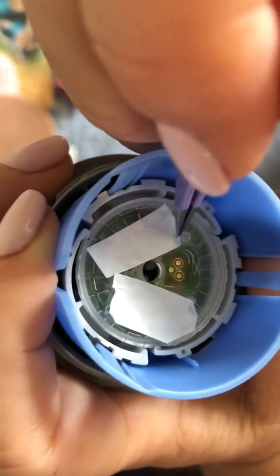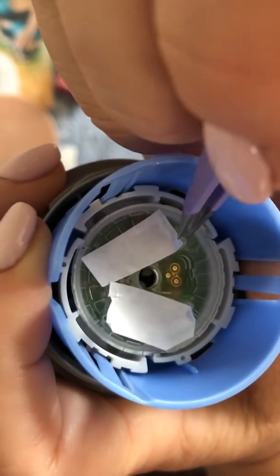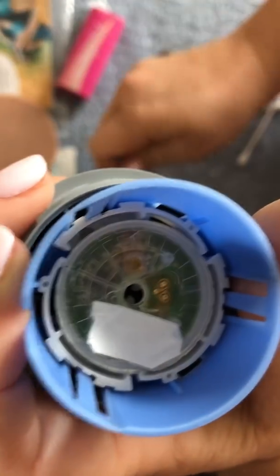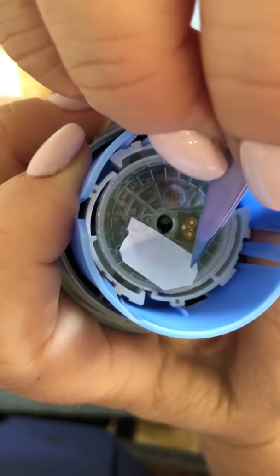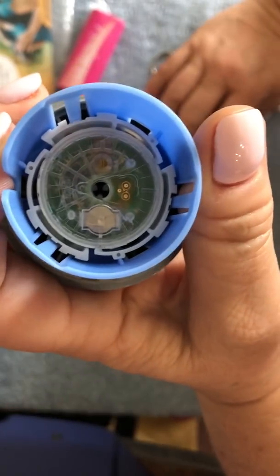Yeah. Normally it doesn't give me this much grief, but of course, you know, it's because I'm on a video, it's going to do that. So this one's going to peel off very easily, if you can see. Okay. So I don't know if you can see it, but the tape is in there. I'll have to work on this one. Let me make sure I can get it. There we go. Okay, so now I have the double-sided tape on there.